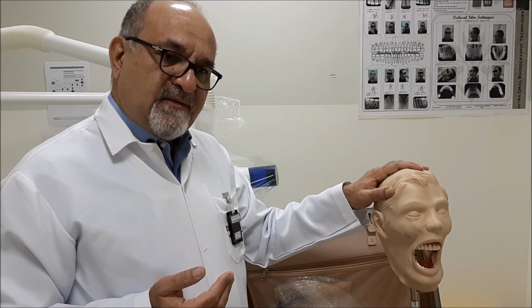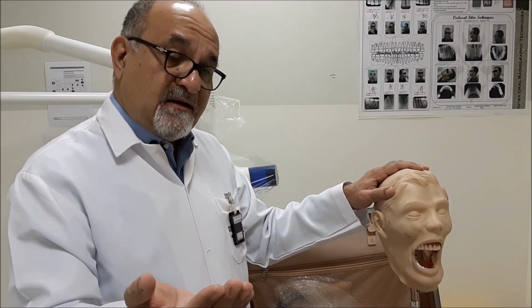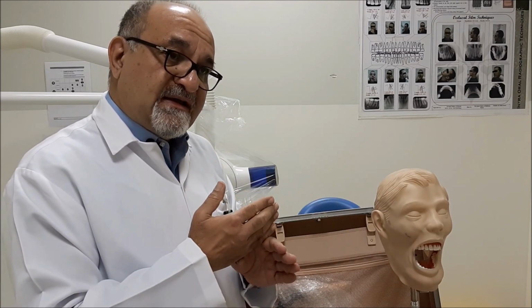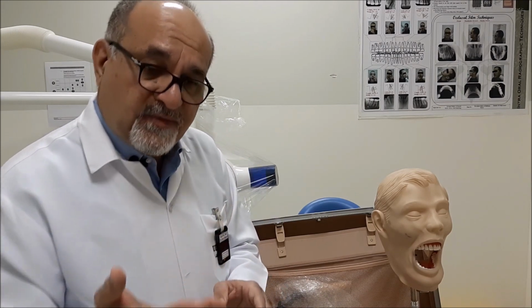When you take the image, the buccal root canal will superimpose and cover the palatal canal, right? The buccal will superimpose the palatal canal. So it is difficult then to tell which is which. So what you do, I will demonstrate it in a simple way.